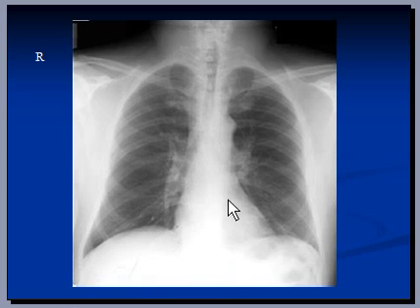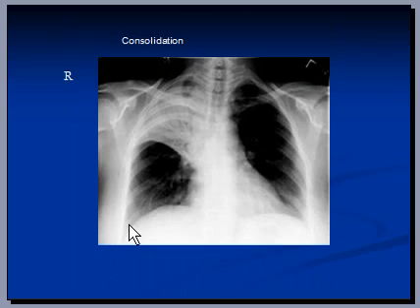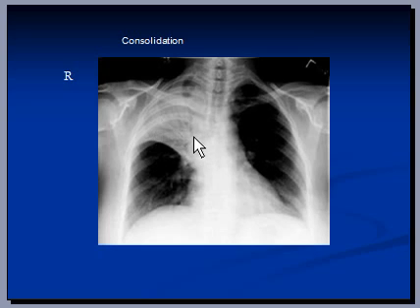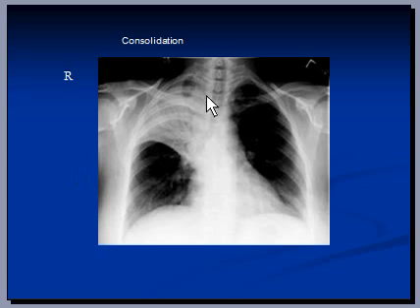Mediastinum is normal in size and shape; cardiac size is normal. Another X-ray shows consolidation in the right superior lobe. You can see air bronchogram, which means that the bronchial branches are filled with air and because the background is opaque you can see these branches clearly. This is the horizontal fissure, so the consolidation is limited to one lobe — this is a very good example of lobar pneumonia.